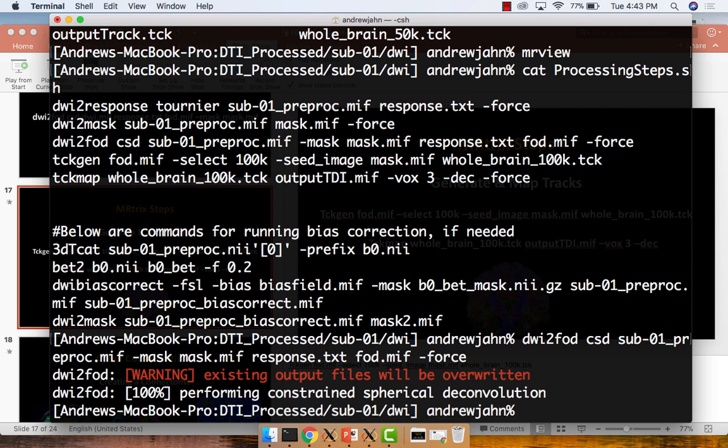Yeah, Sean. Do you have a link of where you got these command lines from, like for a tutorial? Yeah. It's really a lot. Right. Yeah. So first of all, I will have these slides posted online soon. Second, on the MRtrix website, they do have a pretty extensive documentation about, especially if you're just starting out, what steps you will need to do to get your data ready to start fitting these tracks. Yeah. So I'm basing a lot of these on that.